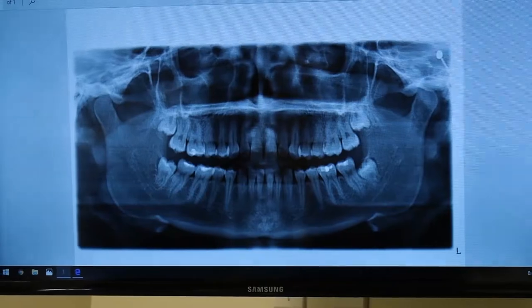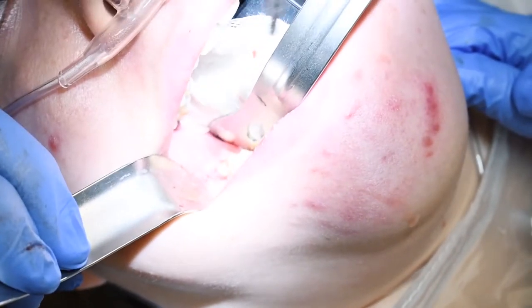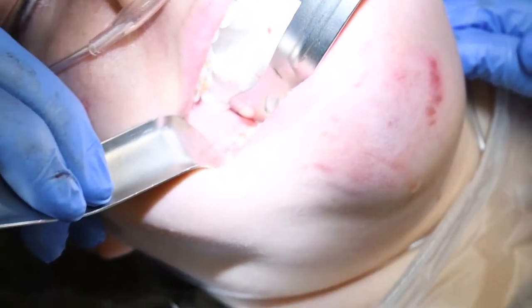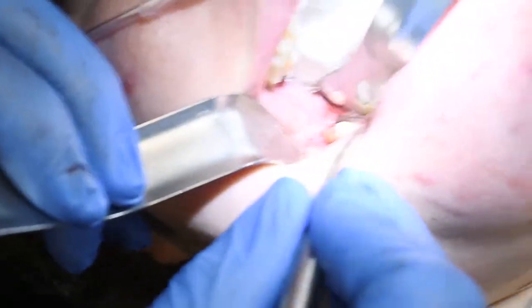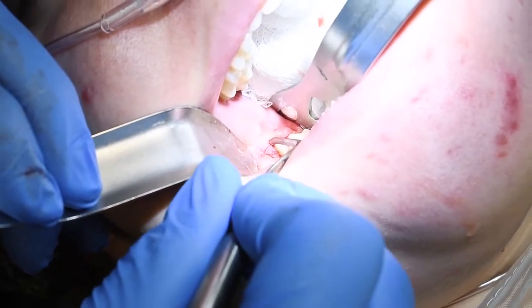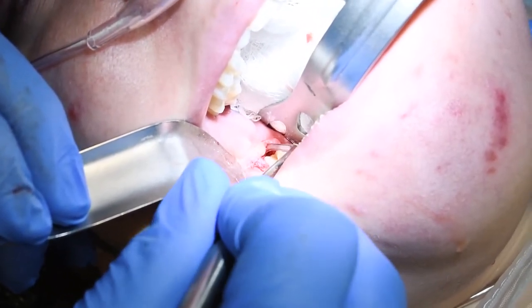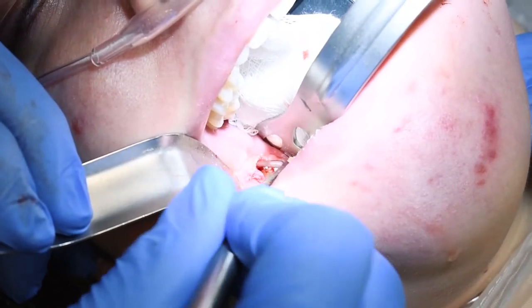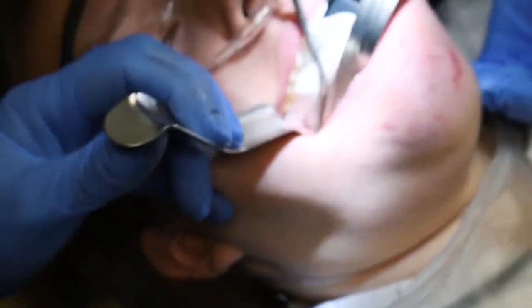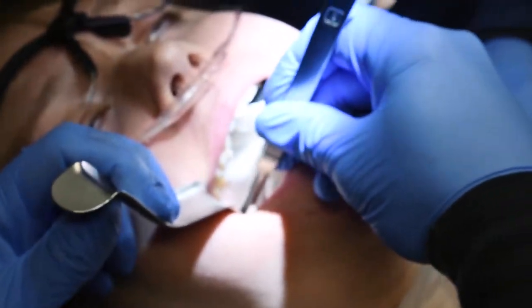If you look at the tissue in here, you can tell this is the area that's really been bothering her — that tissue is swollen, it looks beat up, it's inflamed, just because that thing's catching food. This is one of the main reasons why we get wisdom teeth out. Food and debris gets underneath this little flap, and she's inflamed and sore right now. We're going to get this tooth out — there's actually a little bit of food and stuff that comes out, but it's impossible to keep that clean. Let's make our incision down here.